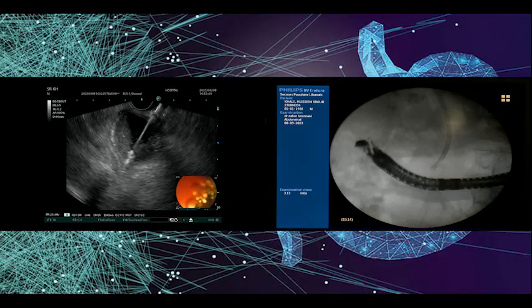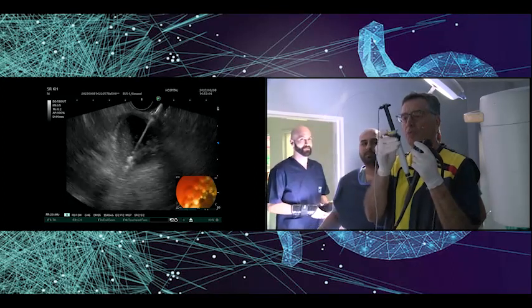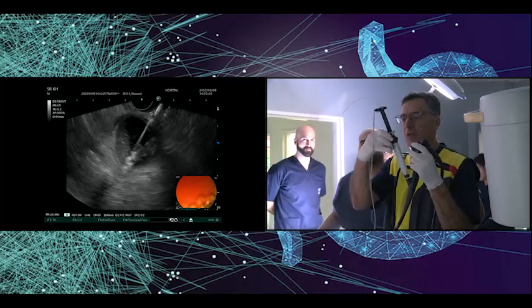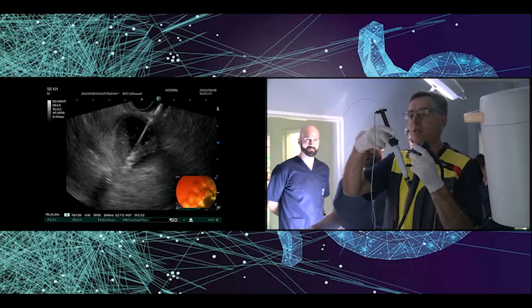I just push a little bit. No, my God, why? It wasn't possible. So now I close, and I will release the distal flange, and you will see.